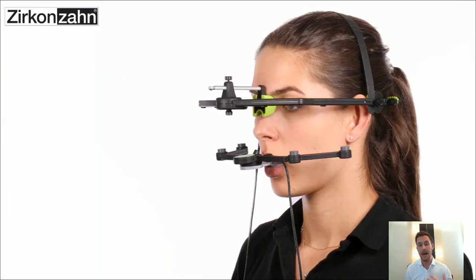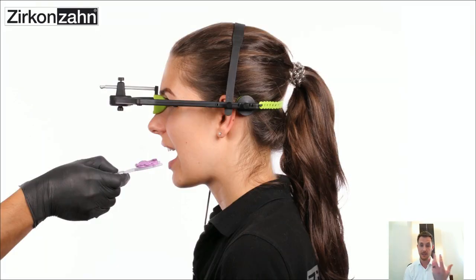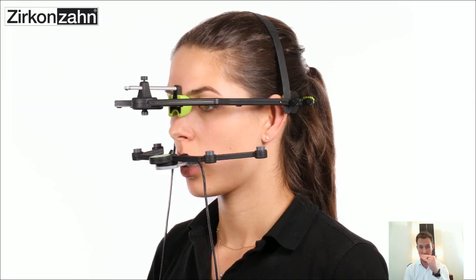So, how does it work? As you can see much better here in this picture, this device is split in two pieces. One piece is attached to the patient's head and the other is attached onto the lower jaw. And both parts are connected via ultrasonic, so if the patient now does movements with the lower jaw, the upper part will record those movements immediately. So how's the workflow? I attach everything to the patient's head. I make registration steps of the natural head position. This is the first step.